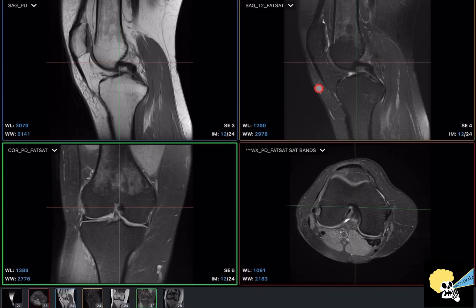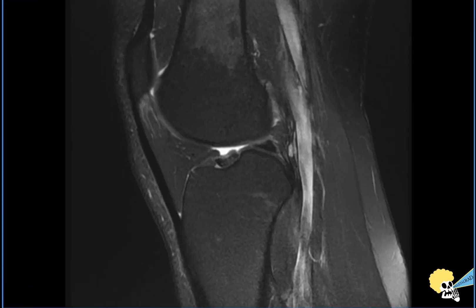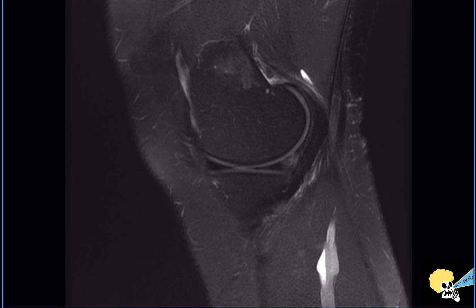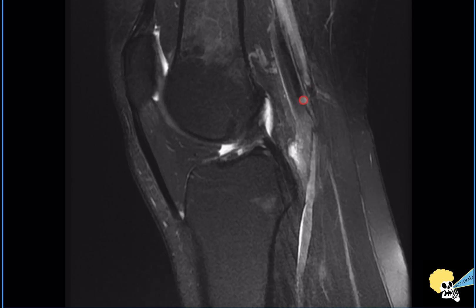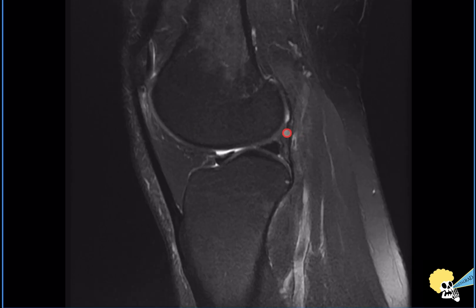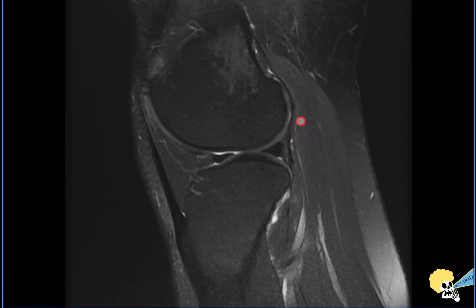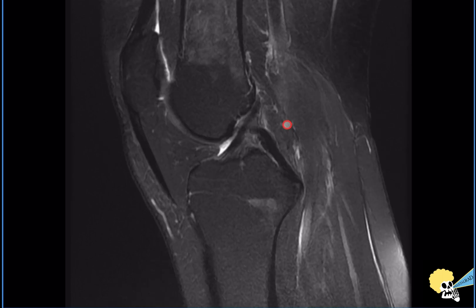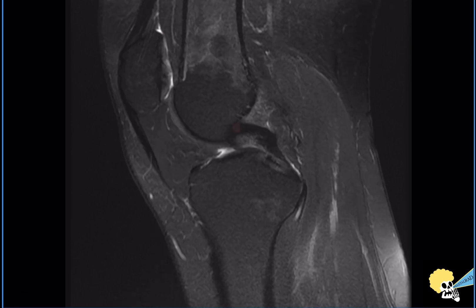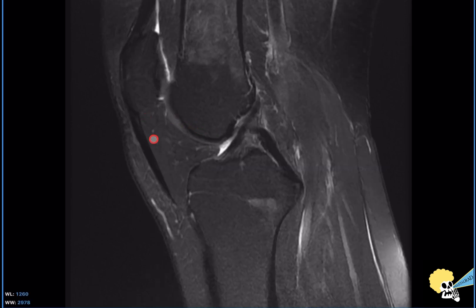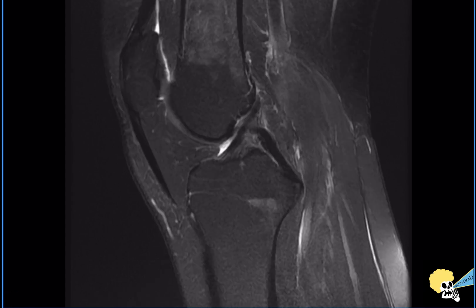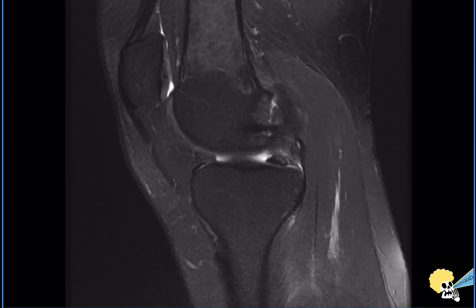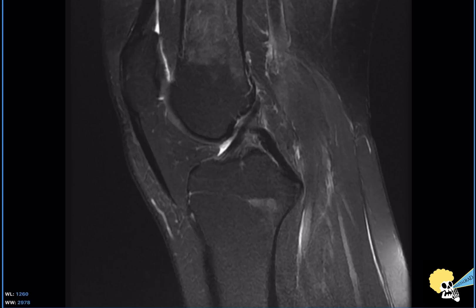Finally, I go to the sagittal images with fat suppression — either a T2 or a proton density. Again, I'm looking at the cartilage, at the weight-bearing and non-weight-bearing femoral condyles. Here I look again for effusion of the suprapatellar recess. I'm also looking at the infrapatellar fat pad — also known as Hoffa's fat pad — to make sure there is no edema or any other abnormality. With that, I've finished the bone and joint search.